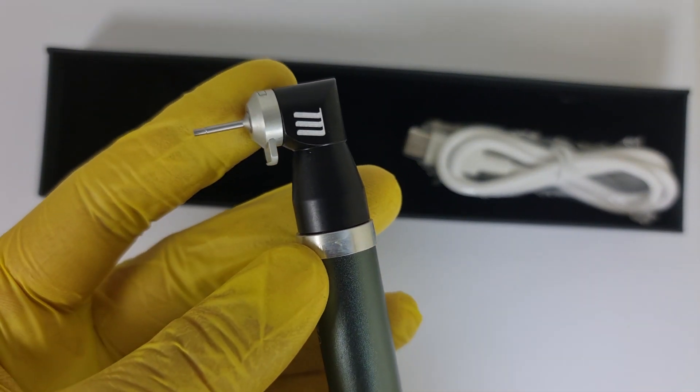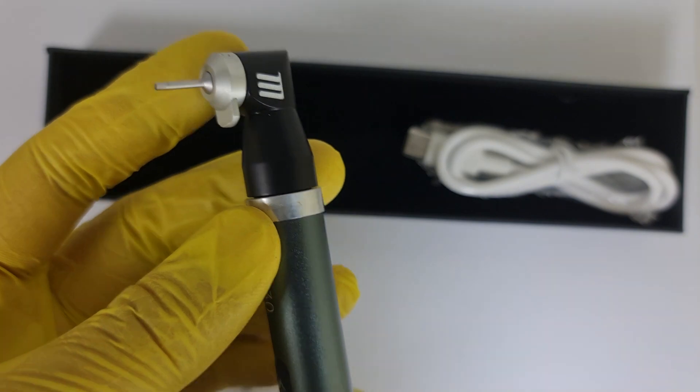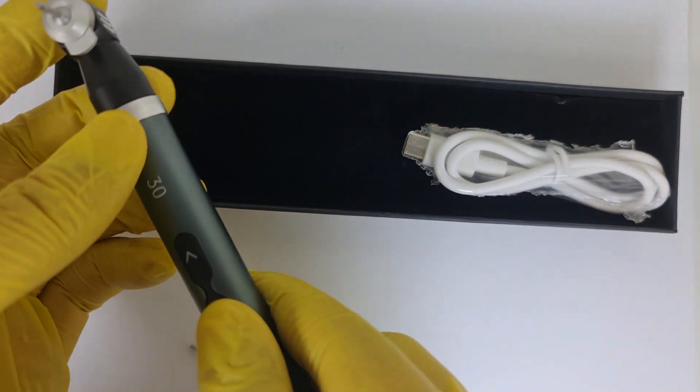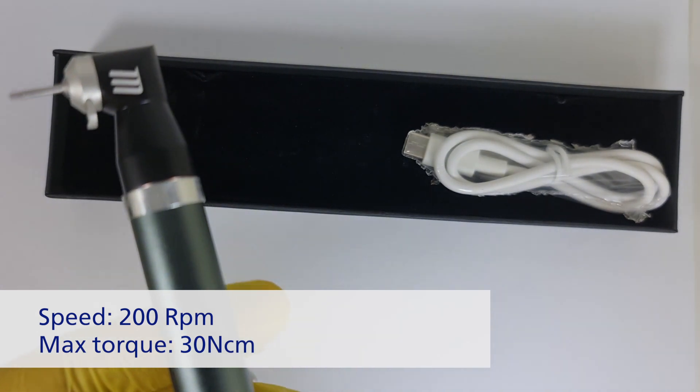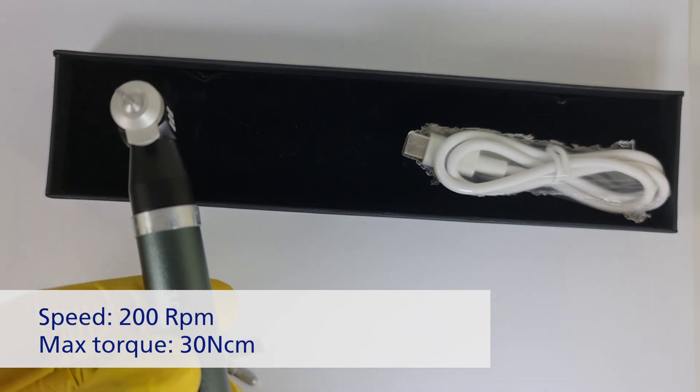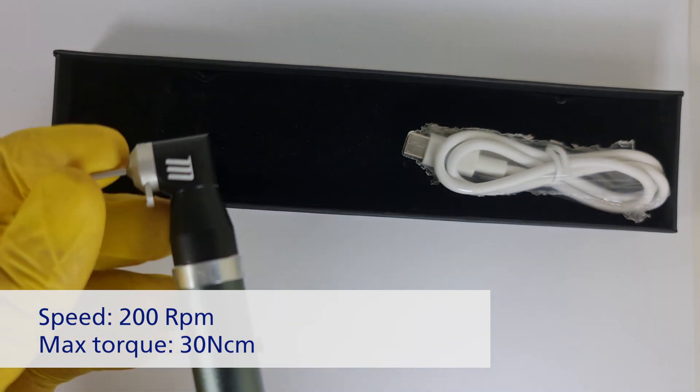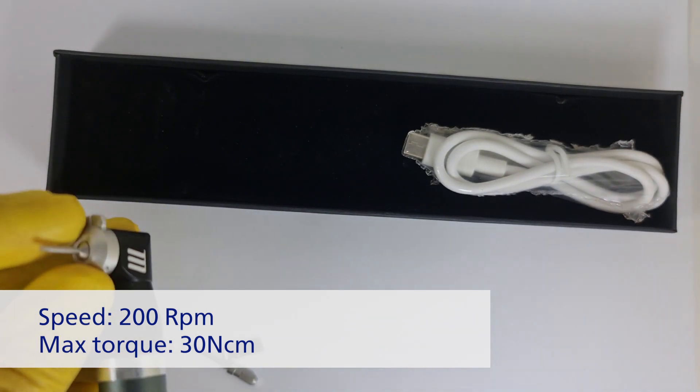There is a bidirectional motor, so with one button you tighten the screw and with the second one you're releasing the screw. Maximum speed is 200 rotations per minute and the torque is limited to 30 newton centimeters.